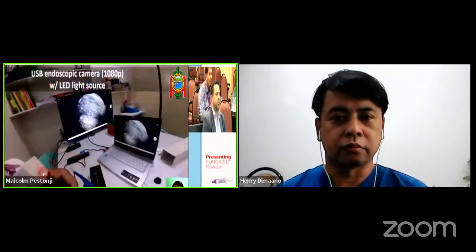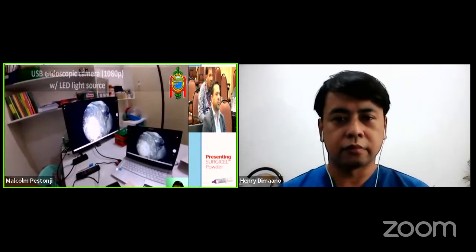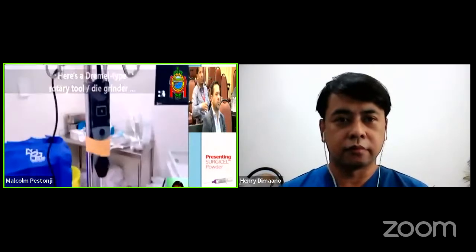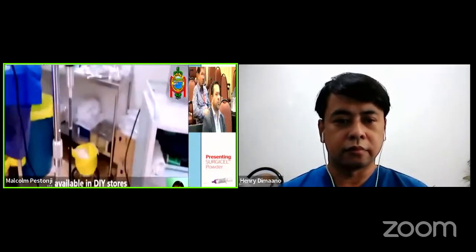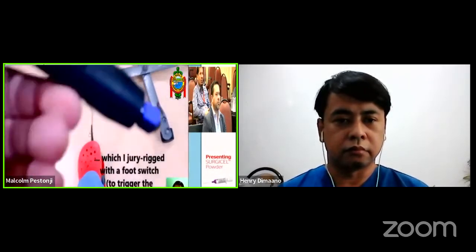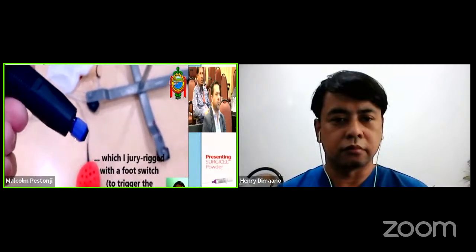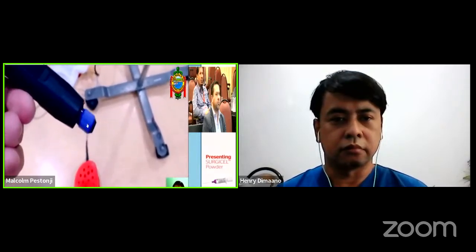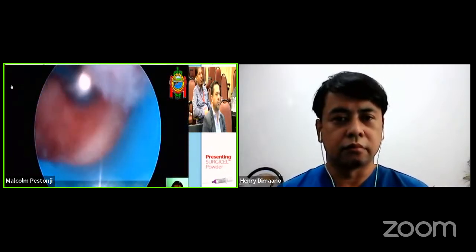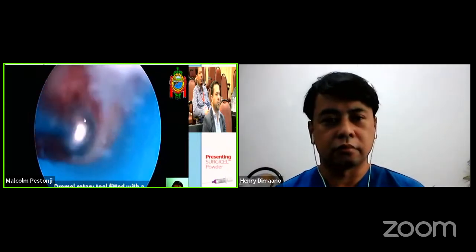Just to show you the scope that I'm using, we don't have an endoscope tower, but this camera over here can link up to a regular laptop via USB port, which we can also link up to a large screen. The drill system is something that I bought from a hardware store. It's a rotary drill type, which I built a foot switch into so that I could trigger it with my foot. And it actually fits a surgical burr. A standard surgical burr can be accommodated. So that drill is what you're seeing here, powering the round burr.